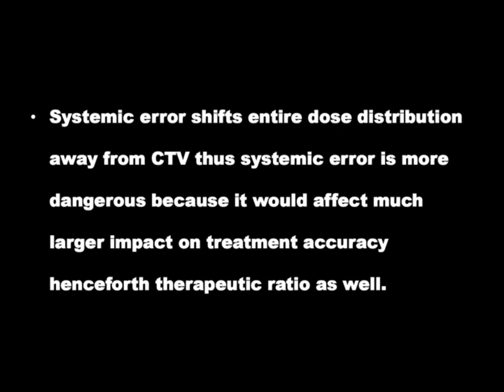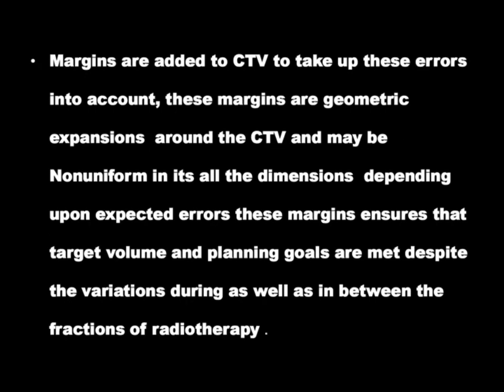Including a lot of assumption based on prior experience and literature to finalize the CTV earlier. What we used to assume is the expected range of tumor and the expected microscopic range of a tumor. The expected range of movement of a tumor can still be controlled, but the microscopic range of the tumor to define the CTV is still a problem.